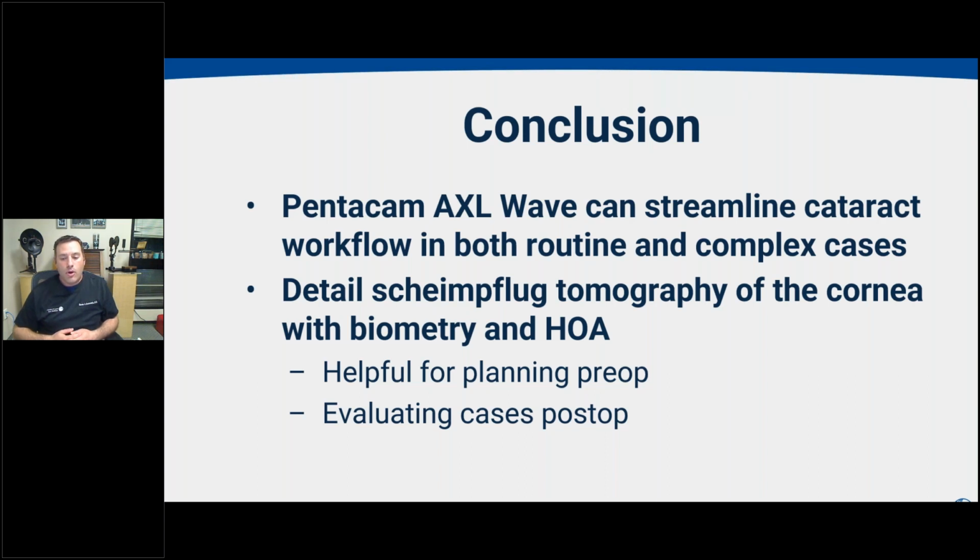So I'm hoping over the last 50 minutes plus or so that I've been able to show how the AXL Wave can streamline your cataract workflow. It takes a lot of measurements in a relatively quick time frame for both eyes. It really gives you an incredibly detailed analysis of the cornea, which is helpful from a refractive surgery standpoint, and cataract surgery is now a refractive surgery.